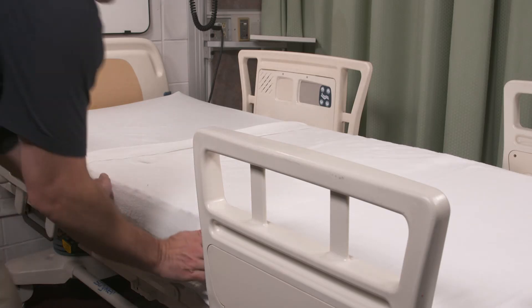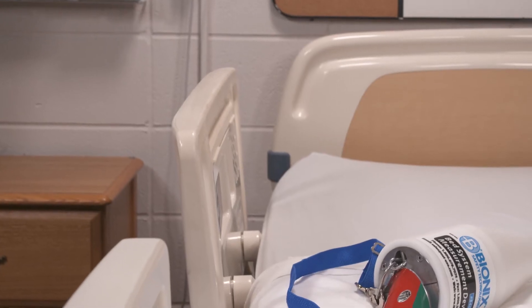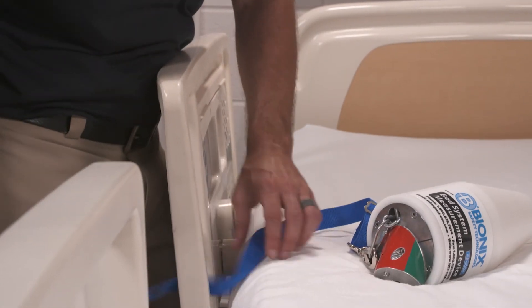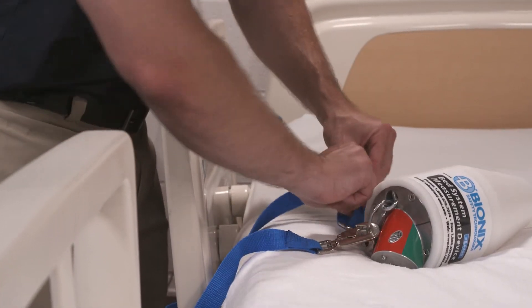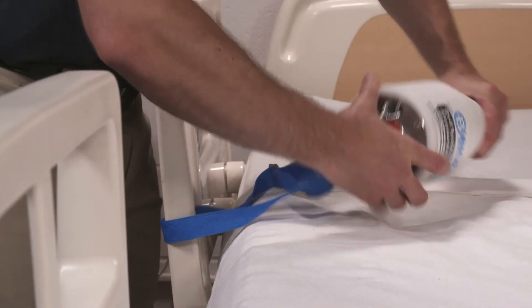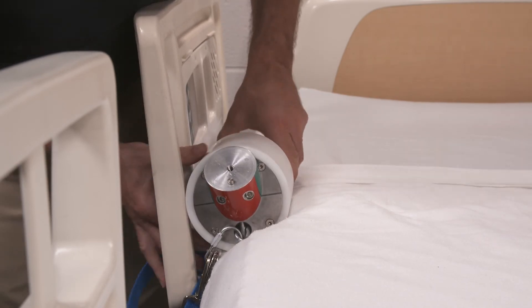Next, firmly push the mattress away from the rail being measured. Place the cone near the rail being tested and attach the safety strap to the rail to avoid injury should the cone fall. Without pushing the cone into the space between the mattress and rail, place the cone into this space with the line on the end of the cone in a horizontal formation.